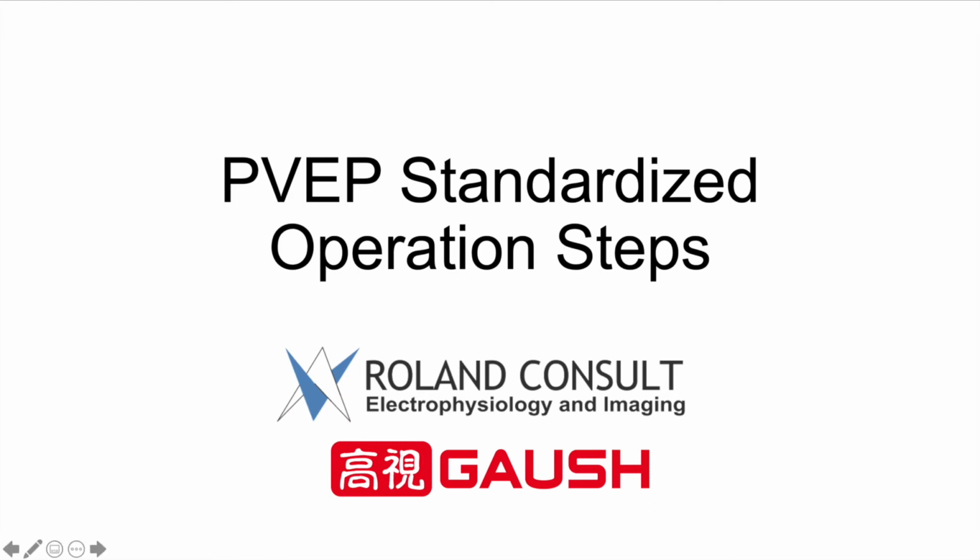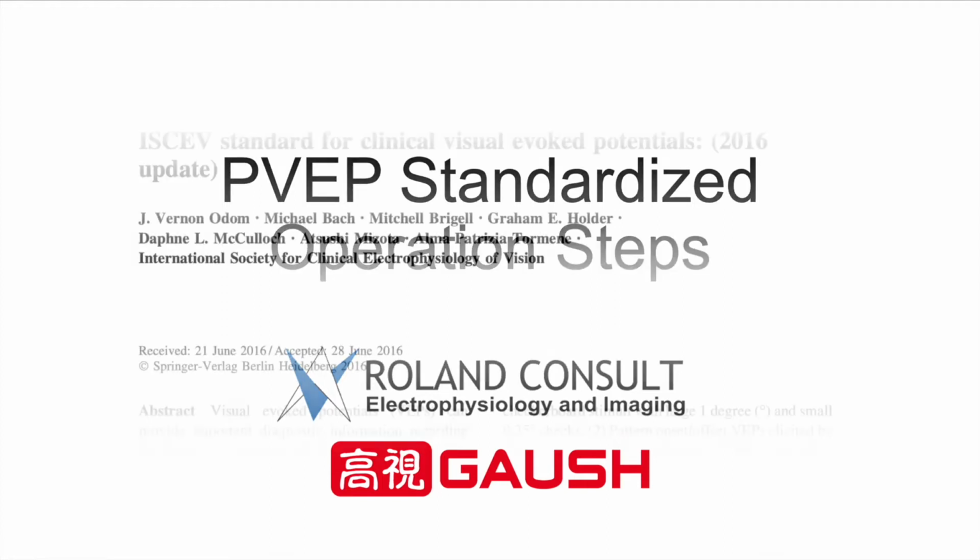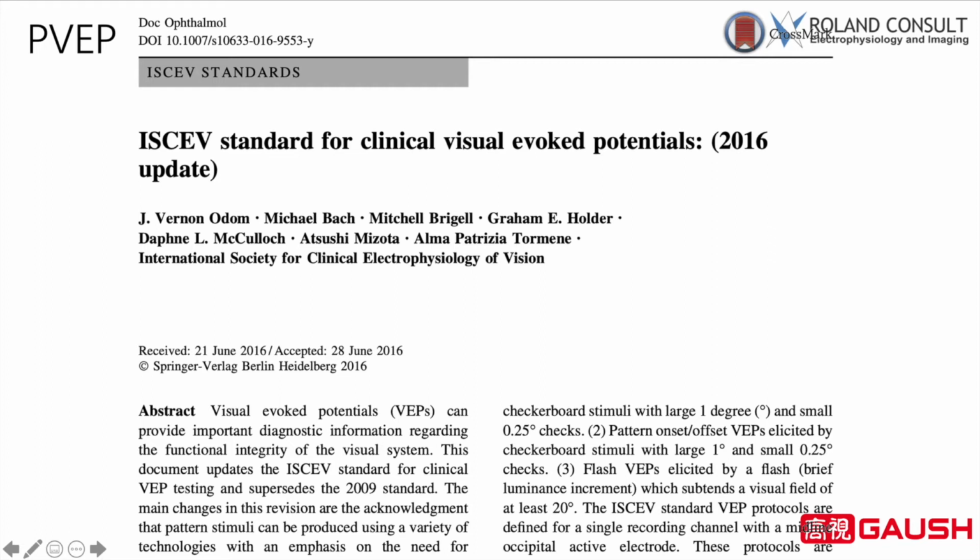Roland Consult PVEP Standardized Operation Steps. These steps are all according to the 2016 version ISCEV standard for VEP.